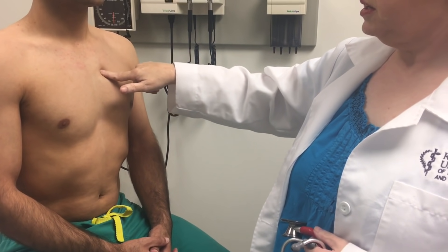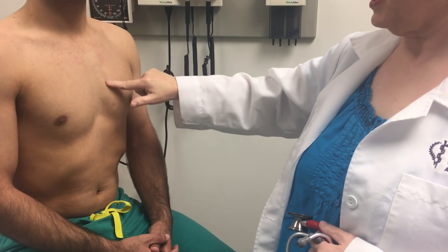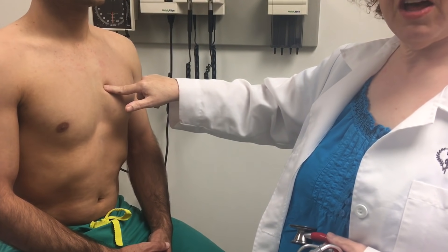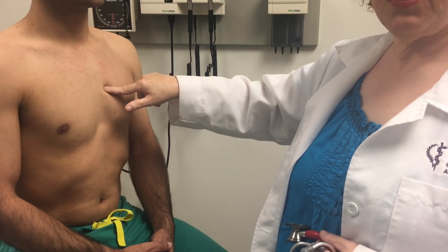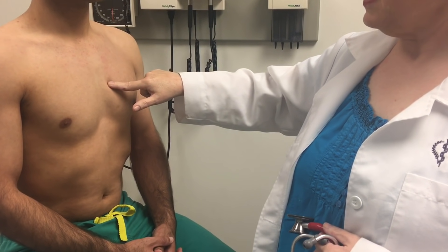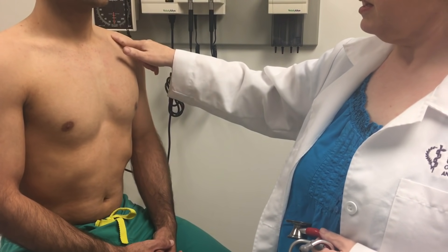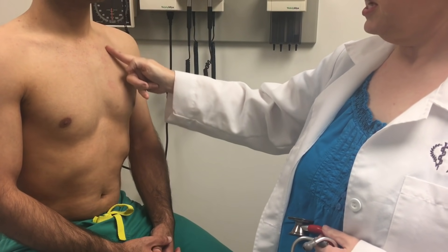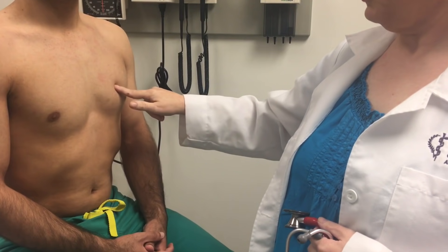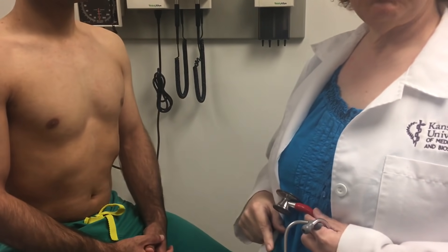Going down from the second intercostal space to the third intercostal space, then to the fourth intercostal space — the fourth intercostal space on the left of the sternum is where we find the tricuspid valve. Finally, in the midclavicular line — halfway across the clavicle — and coming down to the fifth intercostal space, which is about right here on him, I will listen to the mitral valve.